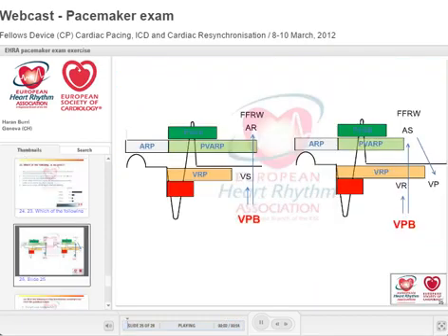If it is shorter, if you have a ventricular premature beat, you may have far-field R-wave oversensing. That can happen, right? Now, if the far-field R-wave oversensing occurs within the PVARP, it'll be classified as AR and will not reset the timers, notably the AV interval.